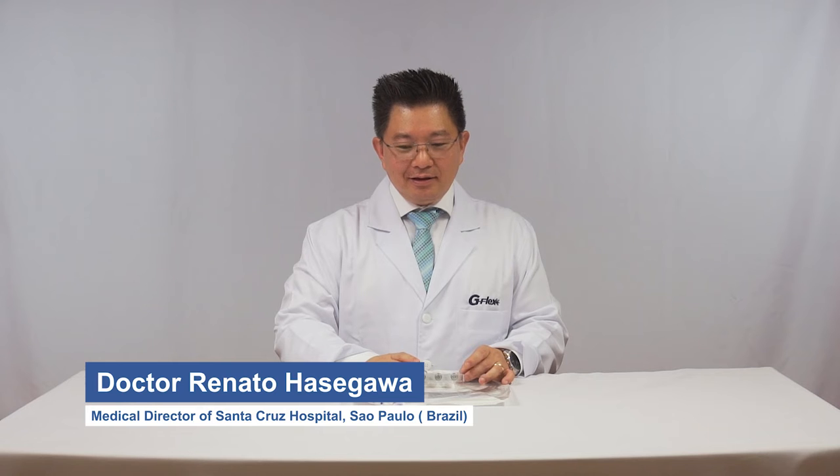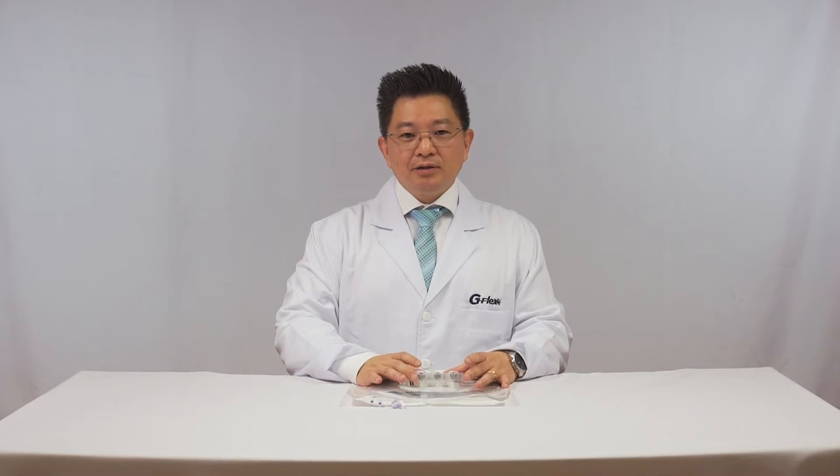How can doctors extract biliary stones? Nowadays, doctors are increasingly performing extractions of biliary stones with sizes up to 20 mm — it's amazing — without lithotripsy. To provide a safe way to extract these stones without using conventional mechanical lithotripsy, G-Flex is now offering a new solution.